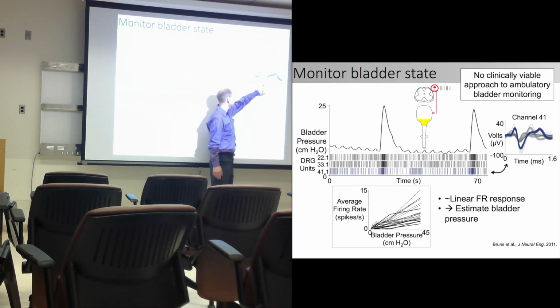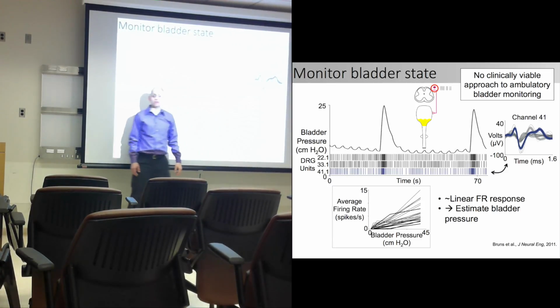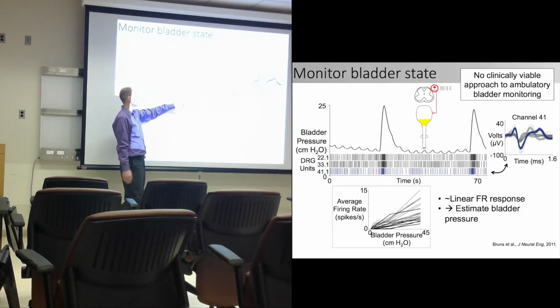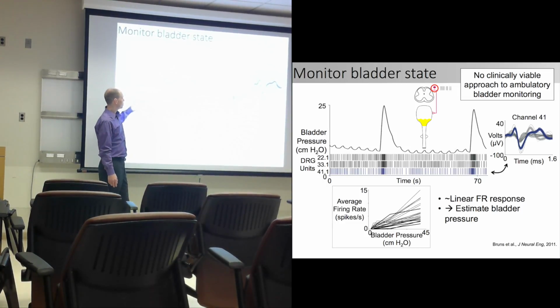And anything that has a similar looking waveform, like this purplish one on top, is considered to be most likely from the same neuron in this trial. So those are all action potentials from one neuron. The purple one corresponds to this individual neuron, and there are two others on other channels.